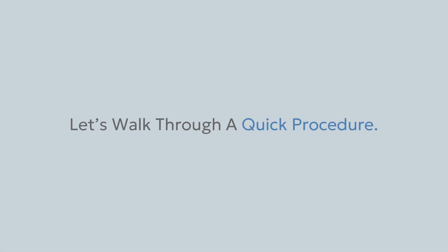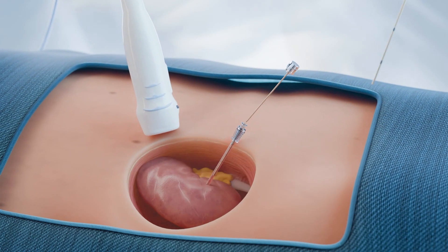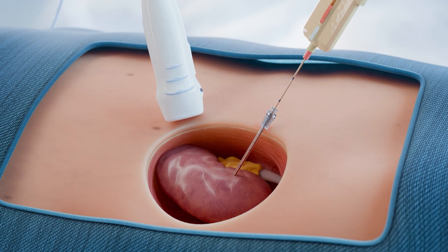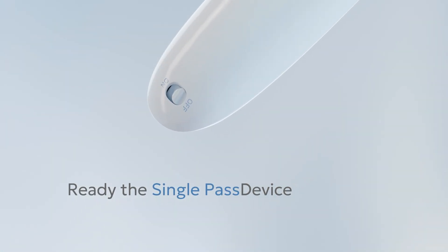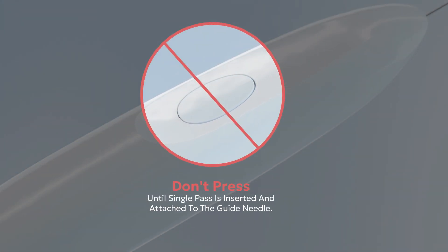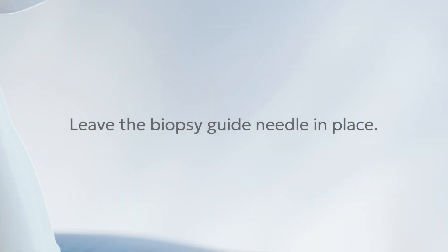Now let's walk through a quick procedure. Here we're doing a kidney biopsy. Conduct your biopsy as normal. After the tissue sample has been collected, ready the Single Pass device by pressing the ON-OFF button to the ON position. Do not press the gray power button before inserting and attaching Single Pass to the guide needle. Leave the biopsy guide needle in place.